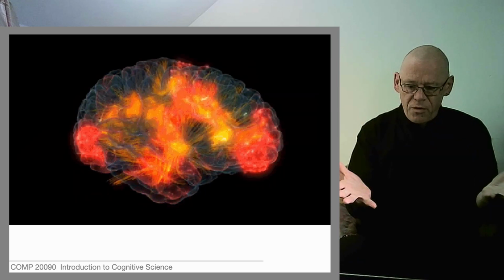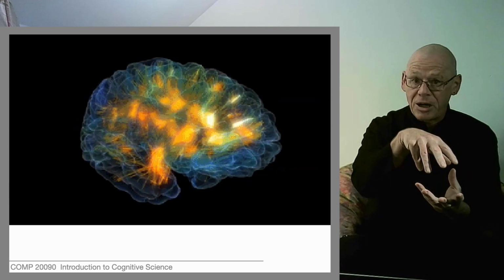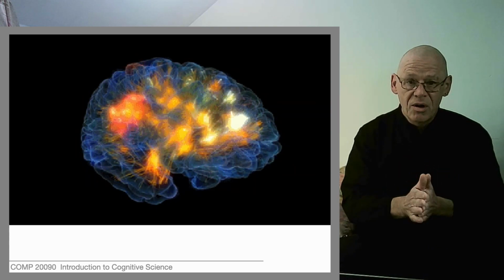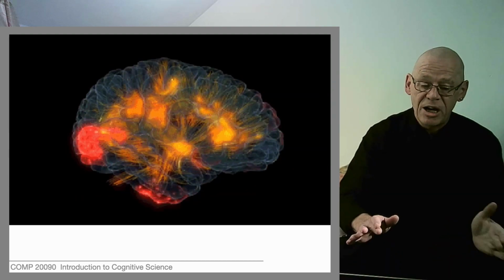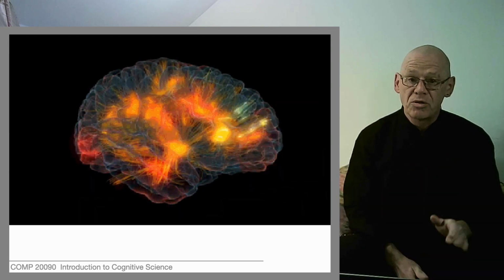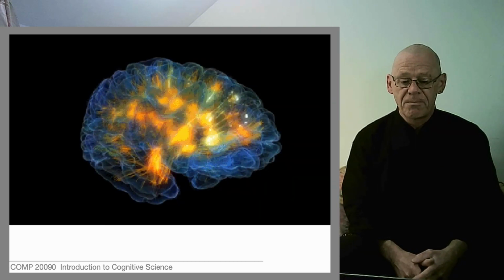So the neocortex, if you imagine it as a big sheet of tissue, has been crumpled up to fit inside the skull. And when you crumple a sheet of paper, some parts, by chance, happen to be nearer the outside than others. So we're getting a really poor record of anything to do with the brain, but it does provide us with a recording which changes sensitively with time and which can be shown to vary as states of consciousness change. So the difference between dreaming and deep sleep, for example, is easy to spot. And the difference between being in a coma and being awake is easy to spot.